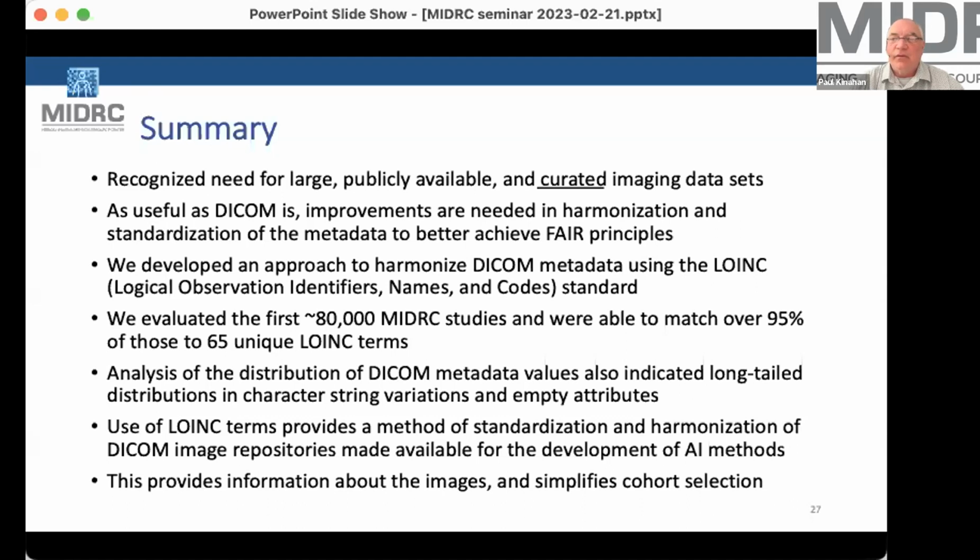So the images are generally scrubbed first by the submitting site, they're reviewed, and then if necessary removed by the MIDRC groups. Typically we don't alter the information though. I think sometimes the data might just be deleted if it contains too much PHI.